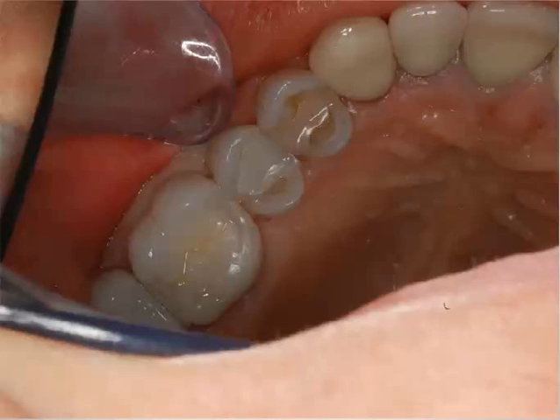For the most part, unless you're in a very unique situation, we're going to have some impingement on the soft tissue as we go through the preparation, as we break the interproximal contact, as we prepare below our existing restorations, our composites. More often than not, we're going to have some minor hemorrhaging we have to deal with. How can we displace tissue?